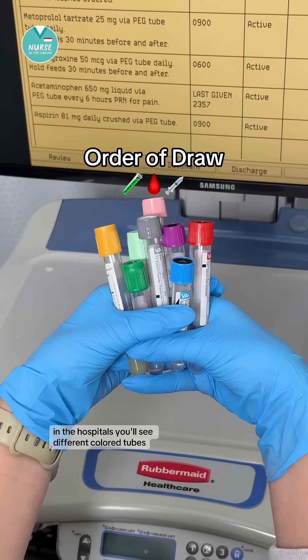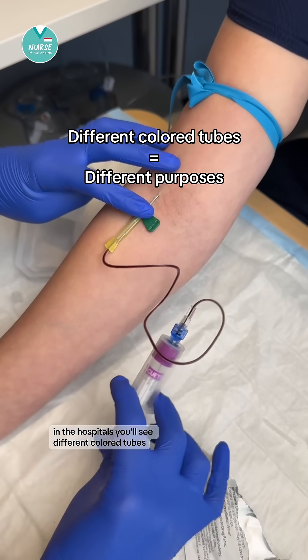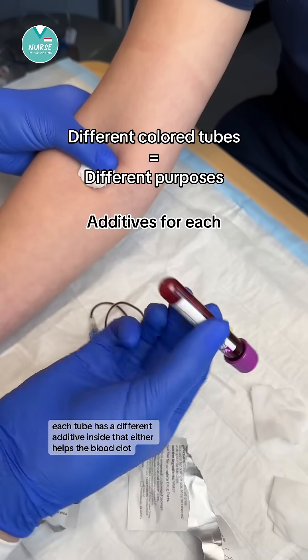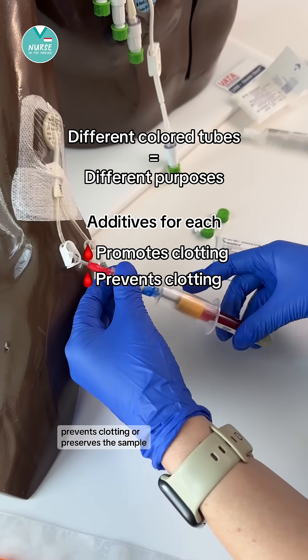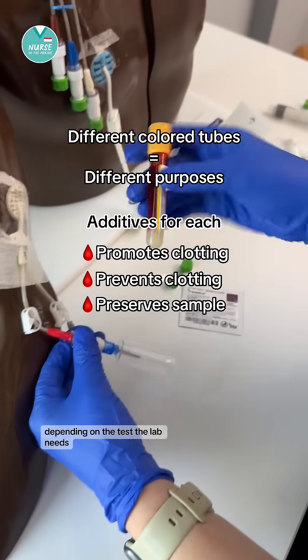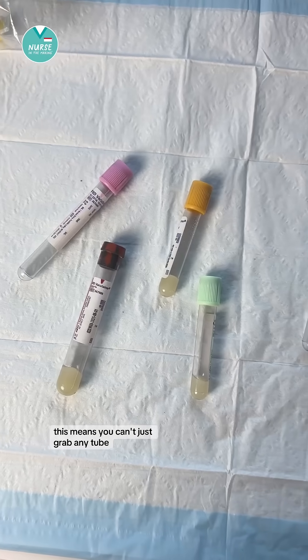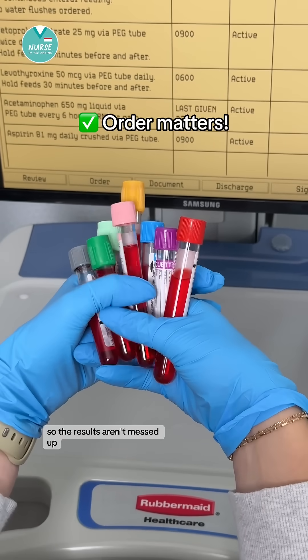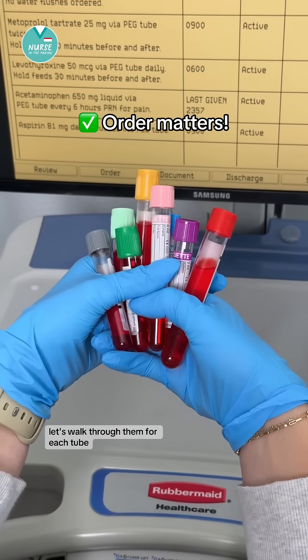Let's talk about the order of draw. In hospitals, you'll see different colored tubes. Each tube has a different additive inside that either helps the blood clot, prevents clotting, or preserves the sample depending on the test the lab needs. This means you can't just grab any tube — you have to pick the right one in the correct order so the results aren't messed up. Let's walk through them.